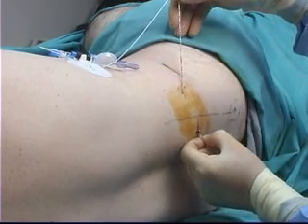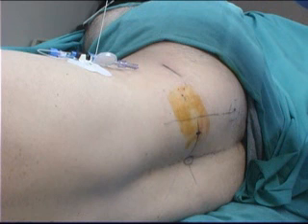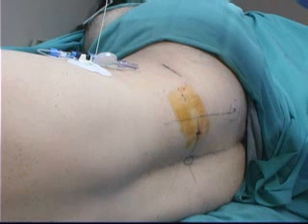This is a sterile procedure. Hold the catheter at the proximal exit site and remove the distal part of the catheter from the skin bridge. Keep this end sterile and remove the entire catheter. Inspect the tip of the catheter for completeness and record this.